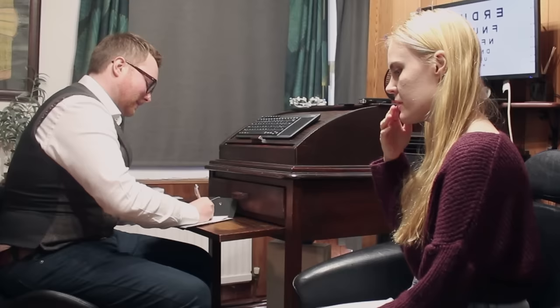We've gone through the preliminary details, name, date of birth, etc. Now, when was your last eye exam? I think it was May. So that's June, July, about 5 months ago. Brilliant. And did you get any glasses at that time? No, I didn't get new glasses. Do you wear spectacles at the moment? I do. I can't read things far away.